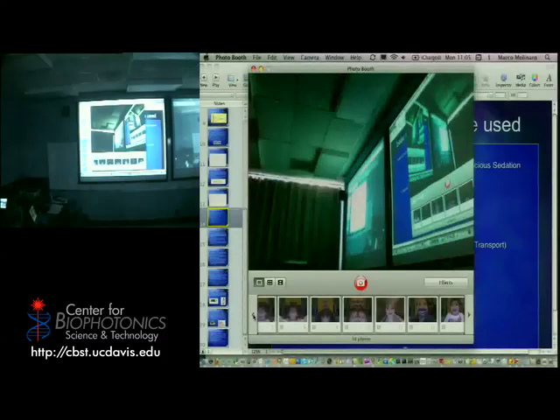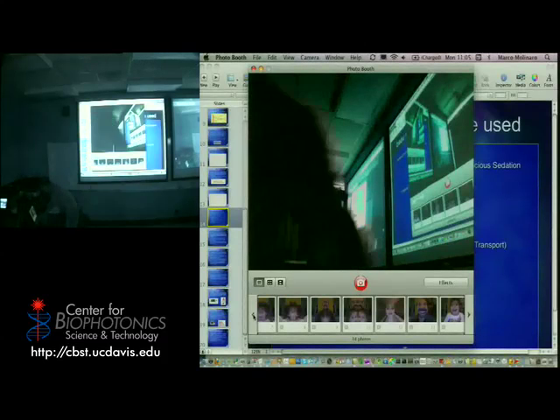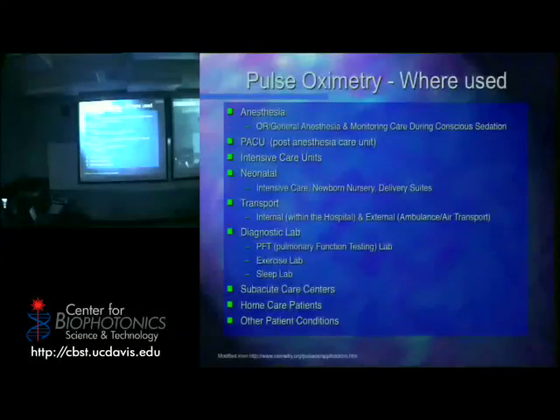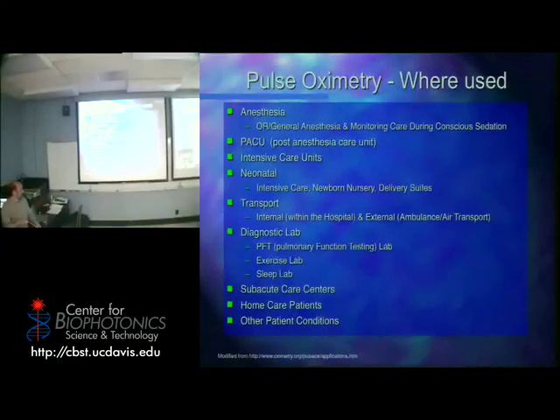And this one has the capability of also monitoring. You can actually record the values. So you could use it over time. The other thing I wanted to pass around for you guys to see is this is what they use in the hospital. They even have a little picture of the finger there. They put the finger like this, and they fold it over, and then they tape it onto your finger, and then this plugs into a machine. Okay? And then they throw these away.